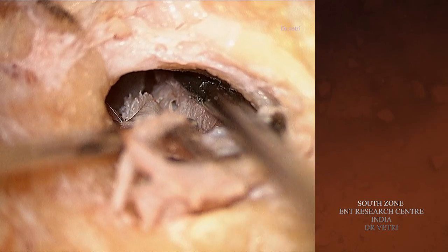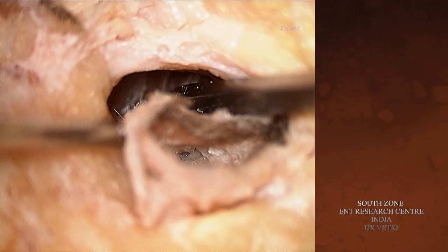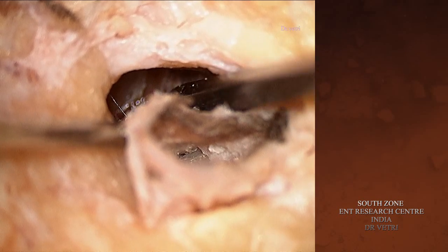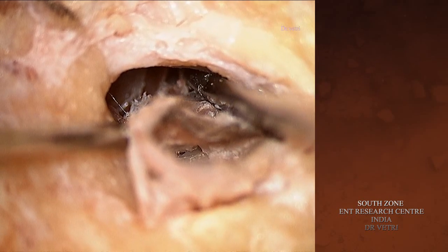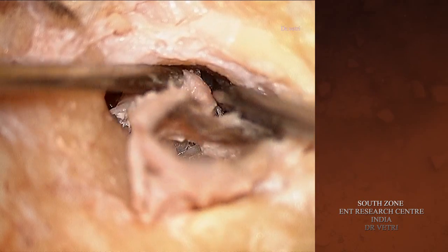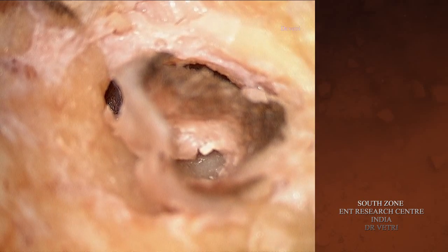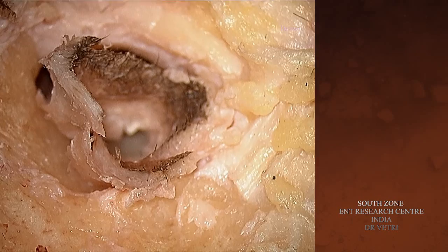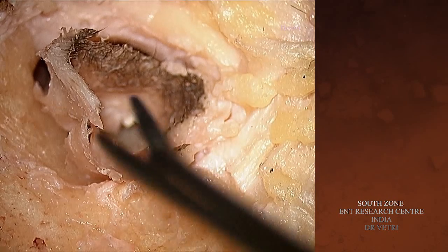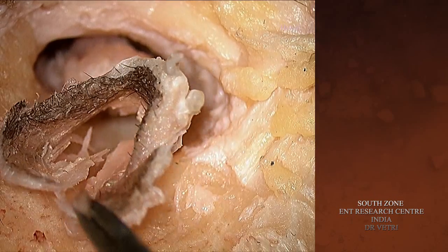And now the skin flap is elevated all around except for the small anterior attachment, and that is now being released. And now the whole skin cuff will be beautifully delivered with the tympanic membrane and the annulus.